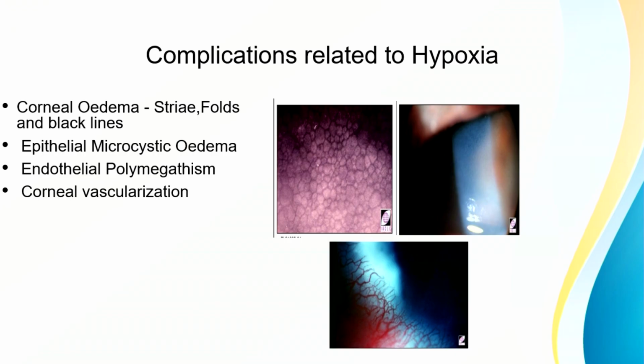And second thing, when we shift someone from hydrogel to silicone hydrogel lenses, hydrogel lenses are thicker in nature. So when we shift, they can have a hypoxic symptom, which has to be told to the patient priorly. So with any hypoxic symptom, any corneal vascularization you come across, just see what lens material they are using and what power they are using. If they are using a hydrogel material, maybe we can shift them to a silicone hydrogel, first thing.